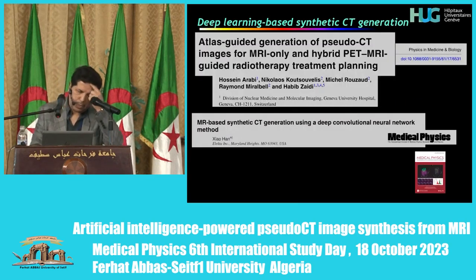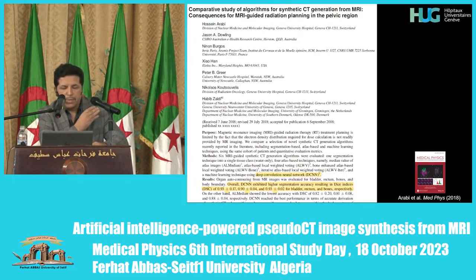We did some work a few years ago with radiation oncology to generate pseudo-CT images using the atlas-based techniques that I mentioned previously. And this paper published by Elekta in 2017 triggered our attention, so we decided to go for a comparative analysis of the bunch of techniques reported in the literature compared to the deep learning based model. And you see that we're not surprised by the conclusion, in the sense that the deep learning model outperformed all the conventional atlas-based techniques.